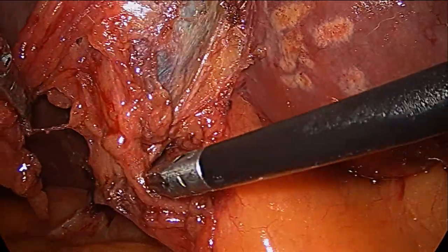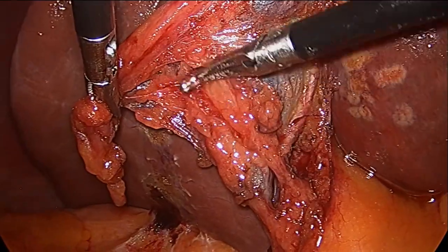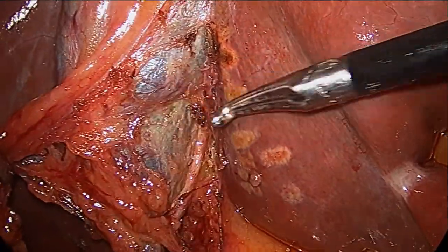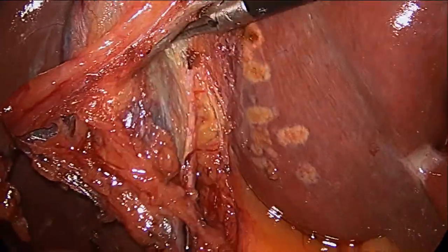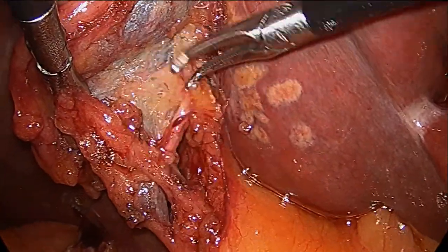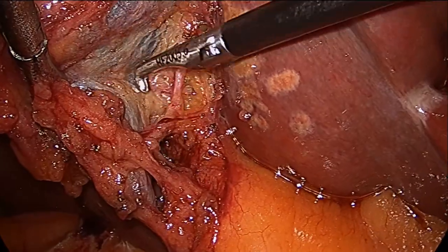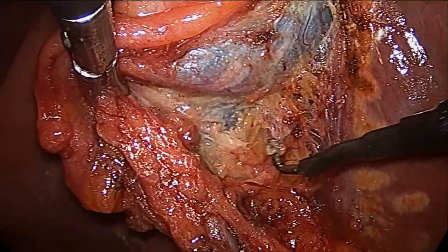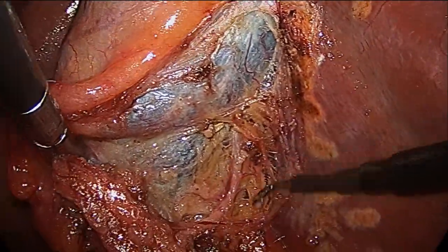I use the dissector again to better isolate all structures and understand their topography. As a result of working with the dissector, I see that there is an additional artery that departs from the artery of the gallbladder and goes to the hilum of the liver. You can see that in this case the diameter of the vessel is smaller than in the first case. However, as I said, I consider it necessary to always trace the topography of such vessels.